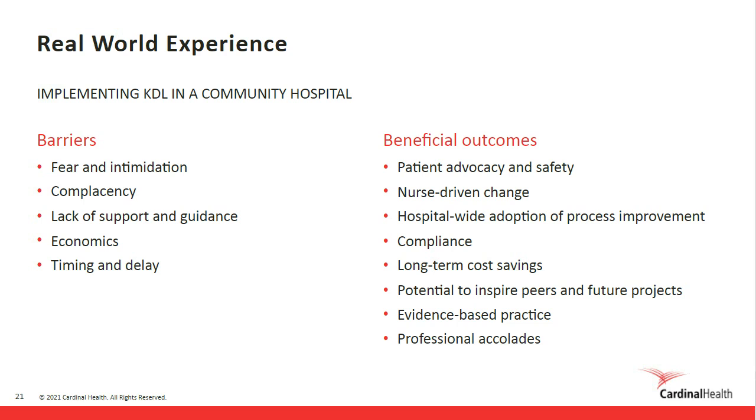I do believe that our emergency department has adopted the system, but I would have to double verify with management. I do believe that these lead wires also get transferred with the patient from the first introduction. So they stay with the patient throughout their admission, and so it's a one-time use. So yes, I do believe that we adopted them in the emergency department.